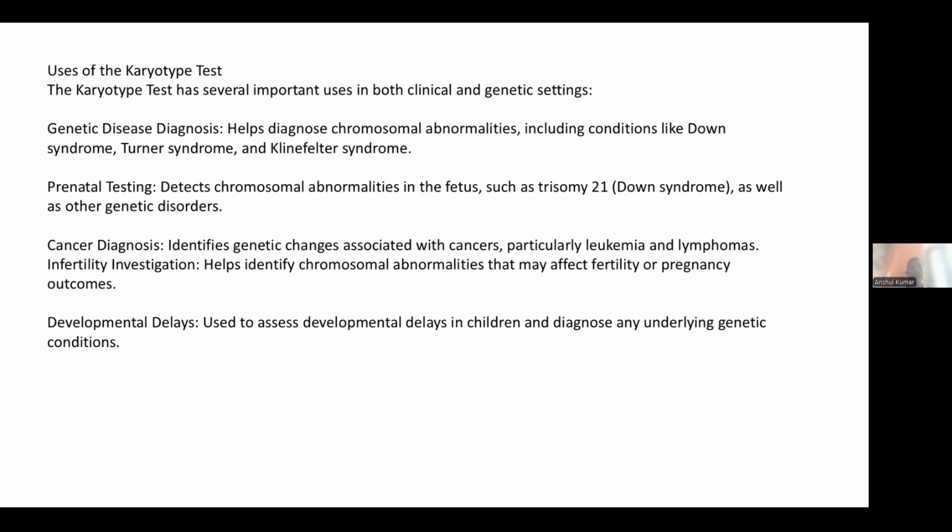So, to summarize, it is one of the most important and advanced techniques, in which cells are visualized at the chromosomal level. We know that when we identify cells through different staining techniques or other methods, we usually see the structure and morphology of cells.